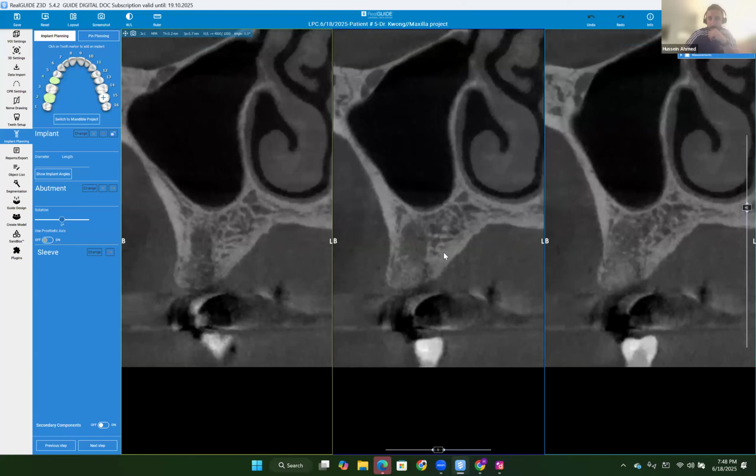Yeah, so that's more than likely just a little soft tissue that was at the very apex of the socket there. So what you'll find is it's going to be kind of like an air pocket when you're trying to do your drilling and placing the implant. So we're going to have a little poor primary stability with it. So when you're placing this implant, definitely under-prep it.